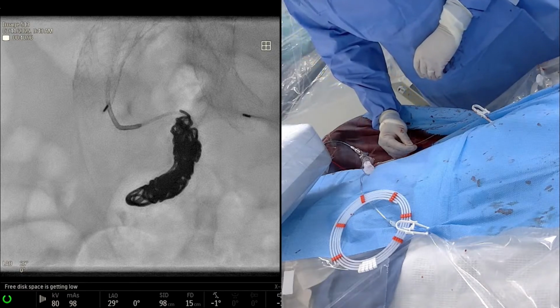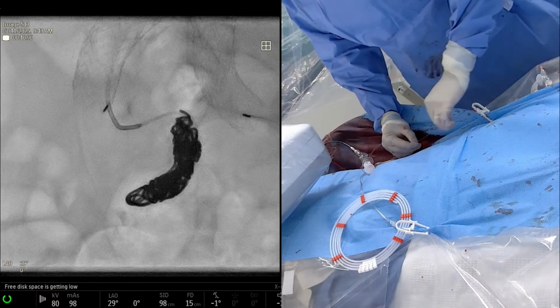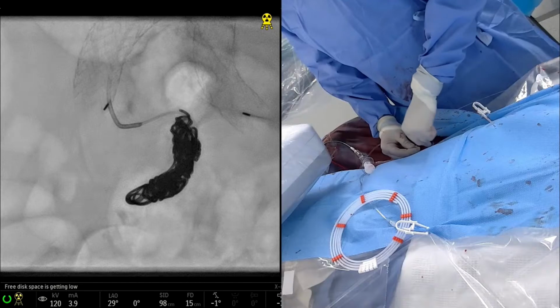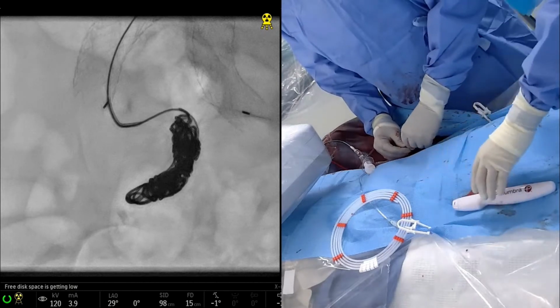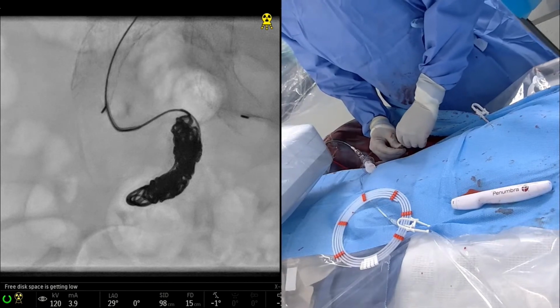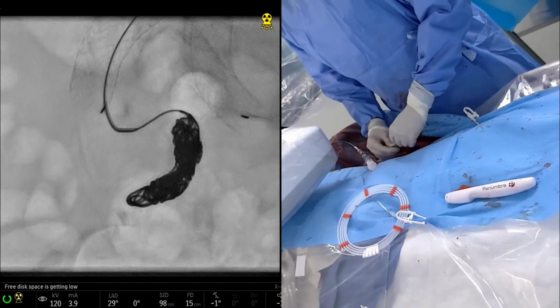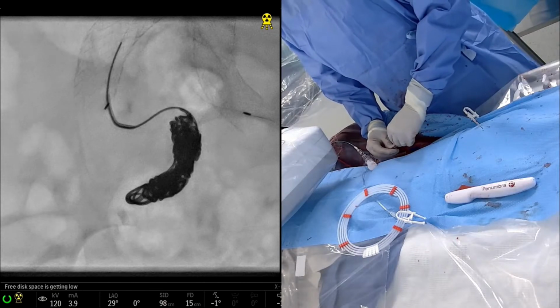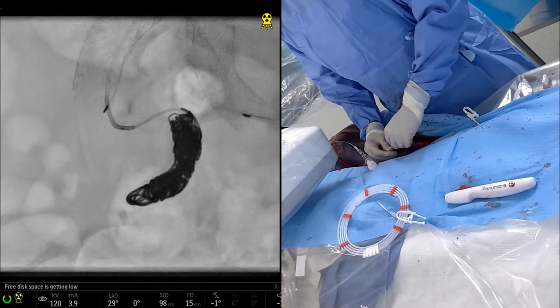Yeah, keep going. Good. Okay. We're just going to fire this in. There it is, it's going in. You just can't see it because it's super soft, right? And it's not undulating. There we see a little bit. I always like that there's not a lot of resistance yet, so there's a lot of space. So you get fooled looking at it as an AP image, right? It looks well packed, but it's really not.